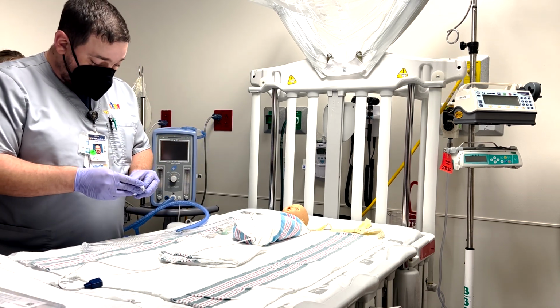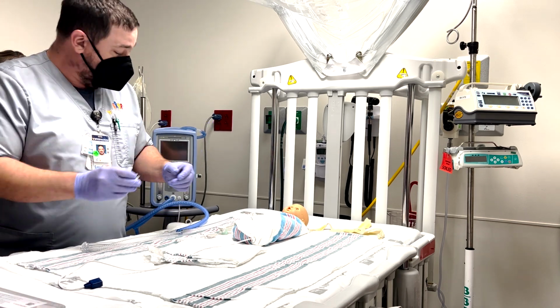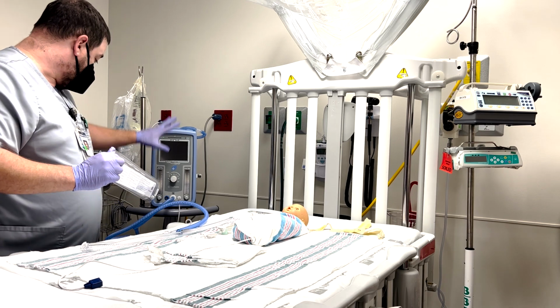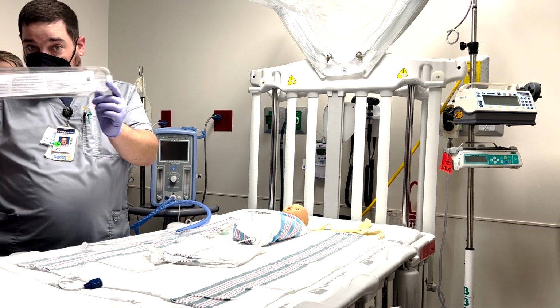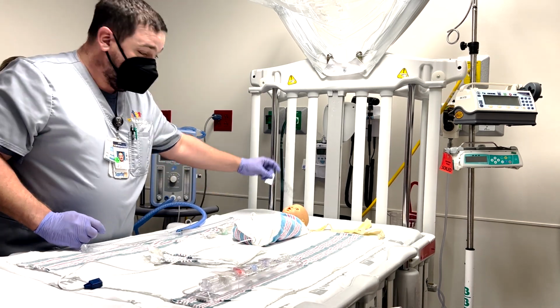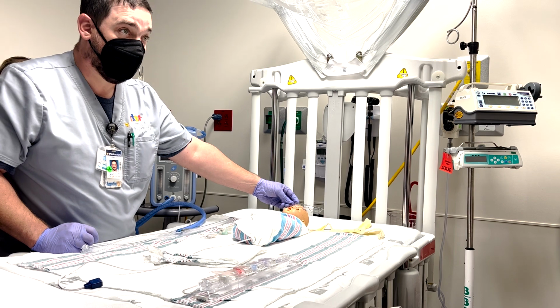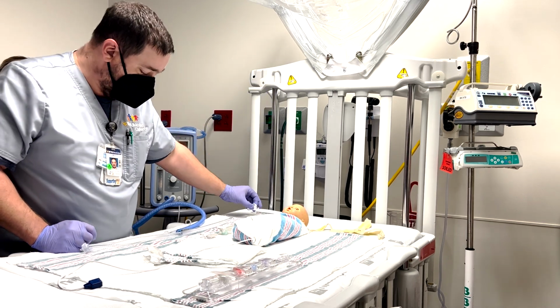Now, I'll pass this around the room here. You have your prongs. Nice little sizing guide. Where does this all come from? Every one of these kits, this whole setup here comes with one of these because we need to be able to put it on the patient's face, right? So, what's in this kit? You have a size guide, which essentially figures out what size your nose is. This is for prongs. This is for mask. It's going to have one of these. Don't lose them. And I'll show you why here in a minute.